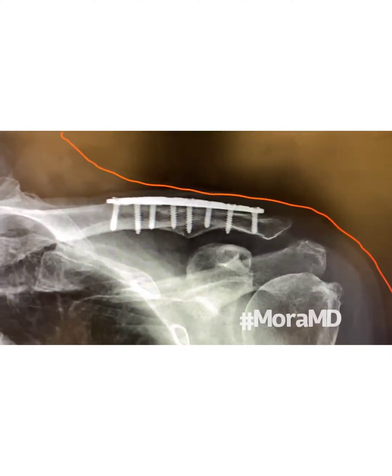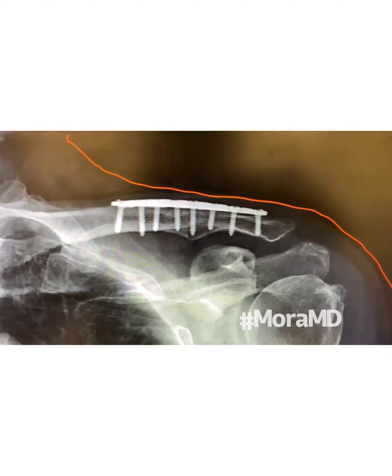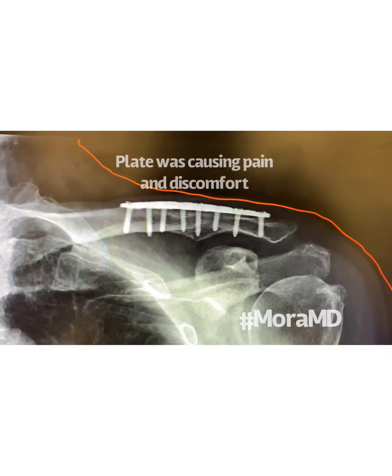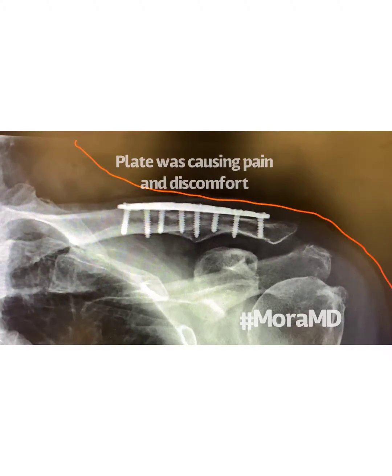Preoperative x-ray of the clavicle plate — the fracture has since healed. The plate was prominent and was creating a pressure effect, especially with the use of a backpack. It's not infrequent that we have to remove these plates.